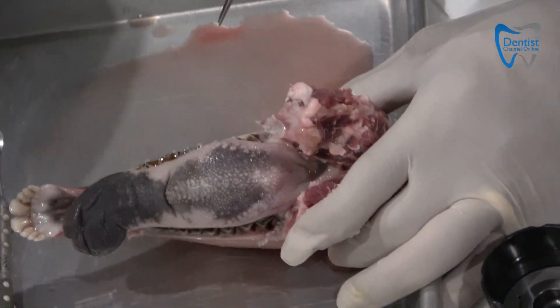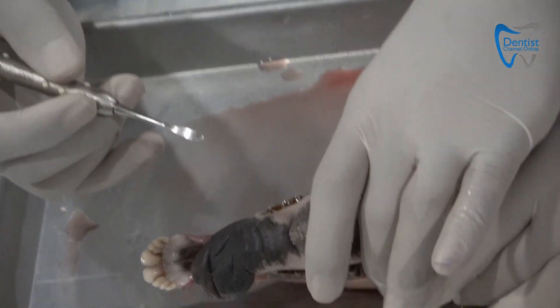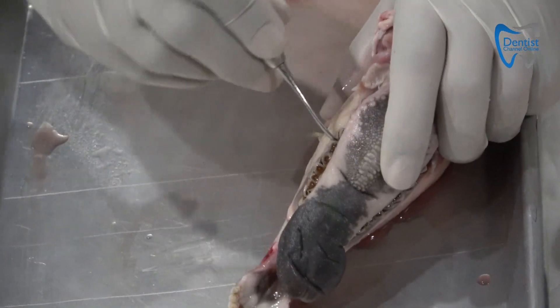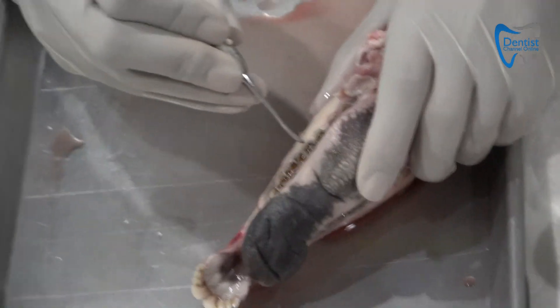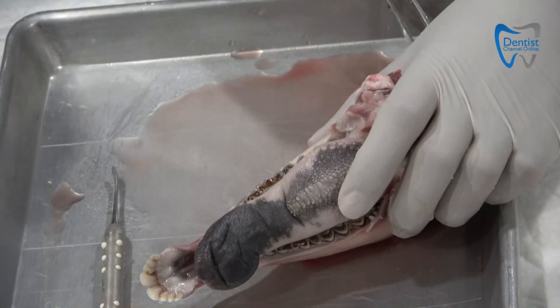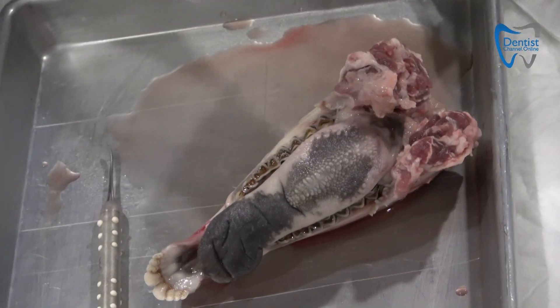Now, if I want to elevate the tooth, it is easy for me to elevate. I am not going to elevate too much because this is just a demonstration. It becomes easy for me to elevate the tooth from here — just elevate it and it will come out. You can see that it started moving. I can take a forcep here and it will come out. Now, suppose if I have to take a block graft — this is an advanced machine, so we are doing more of the surgical basics.